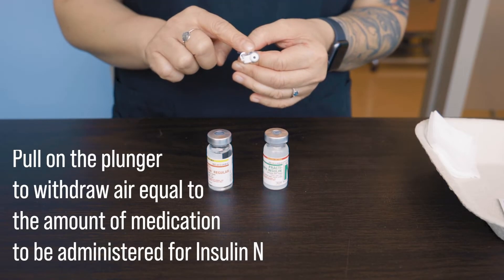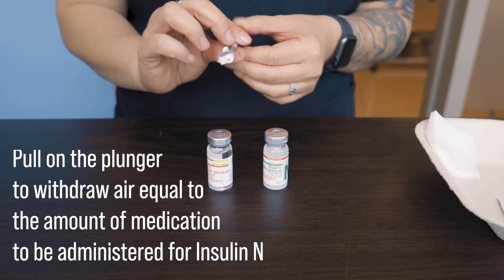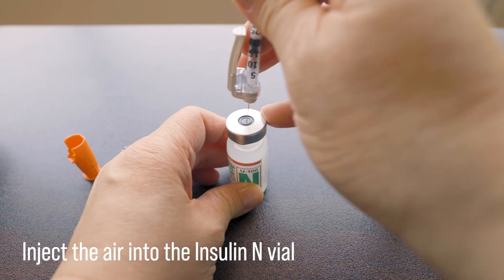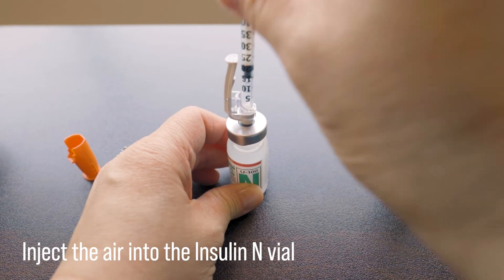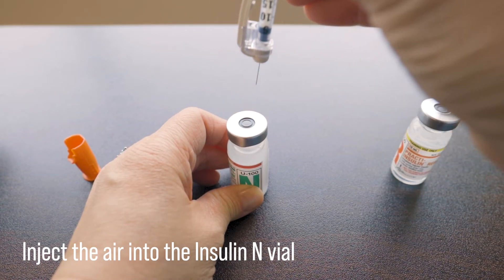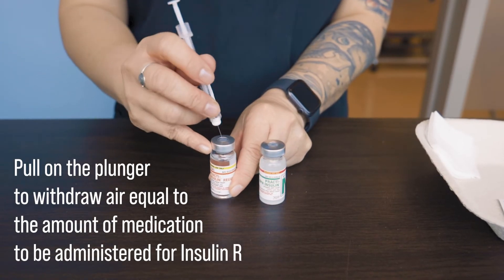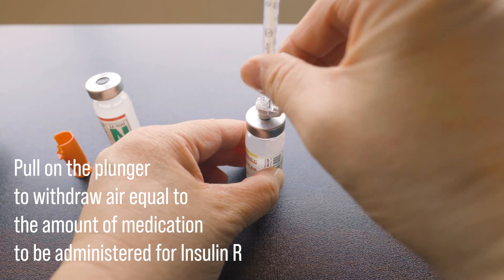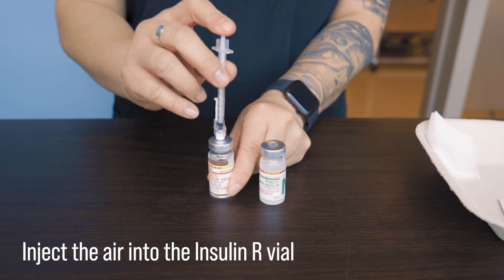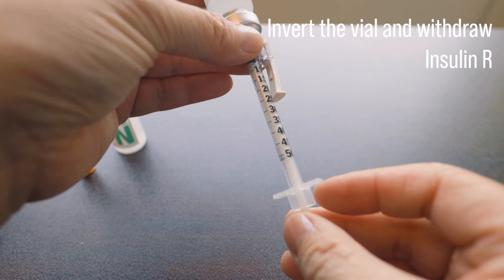We're going to withdraw air equivalent to the amount of insulin that is ordered for each medication. Let's say we need 15 units of insulin N. We are going to prepare the insulin N vial by injecting 15 units of air into it, taking care that the needle does not touch the solution. Next, we will withdraw air equivalent to the amount needed for insulin R — let's say that amount is 10 units. We are going to inject that air into the vial and, without removing the needle, invert the vial and withdraw 10 units of insulin.